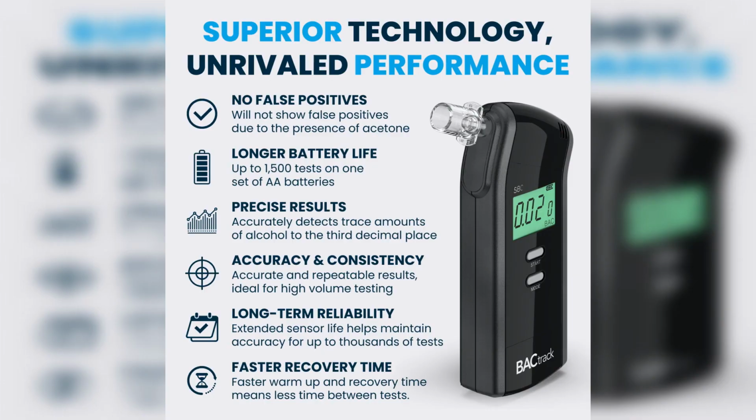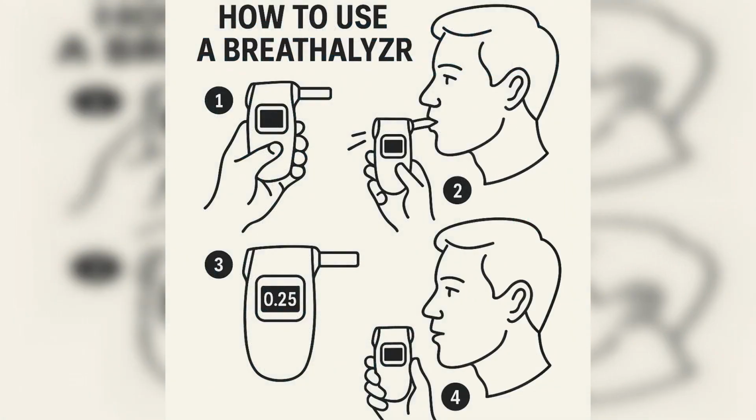What factors can affect the work of the breathalyzer? It is very important to find out what the breathalyzer reacts to. So, if the driver on the eve of the test did not drink alcoholic beverages, and the device showed otherwise, perhaps the reason lies in the use of the following: tinctures, medicines containing alcohol. Kvass. This drink contains 0.1 to 2.6% alcohol. Therefore, it is better for the driver to refuse even 1 glass of kvass. Kefir, characterized also by an insignificant alcohol content. It is worth noting that a positive result will be obtained after drinking 6 liters of fermented milk drink.